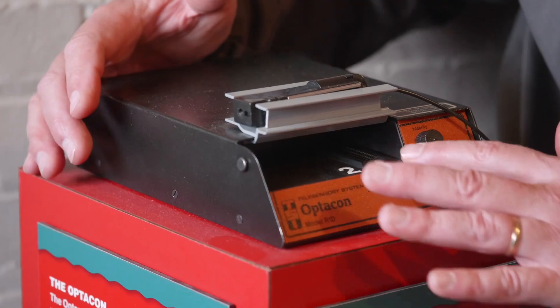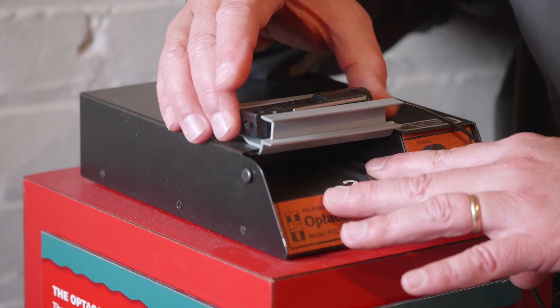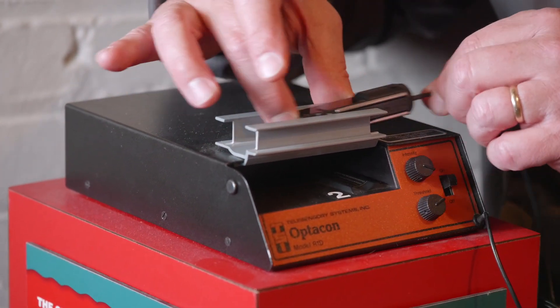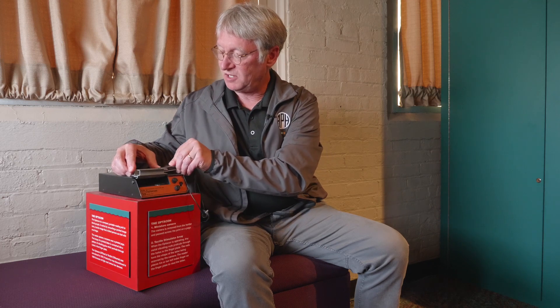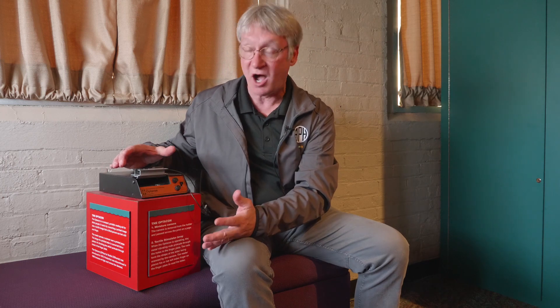On the front, it has a little inset place where you're going to place your finger. I'll explain that in a minute, and then on top is a little bracket that holds the camera unit. The Opticon — the name itself stands for Optical to Tactile Converter.